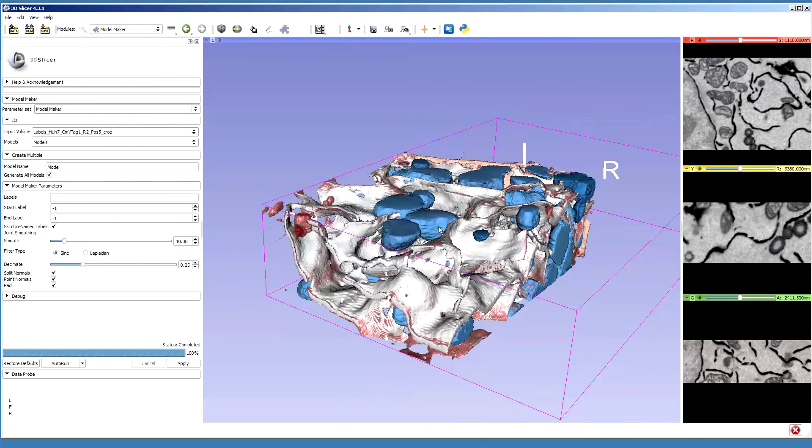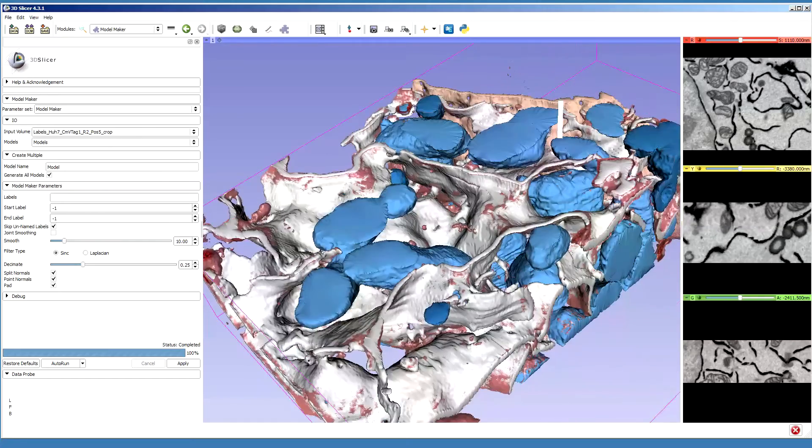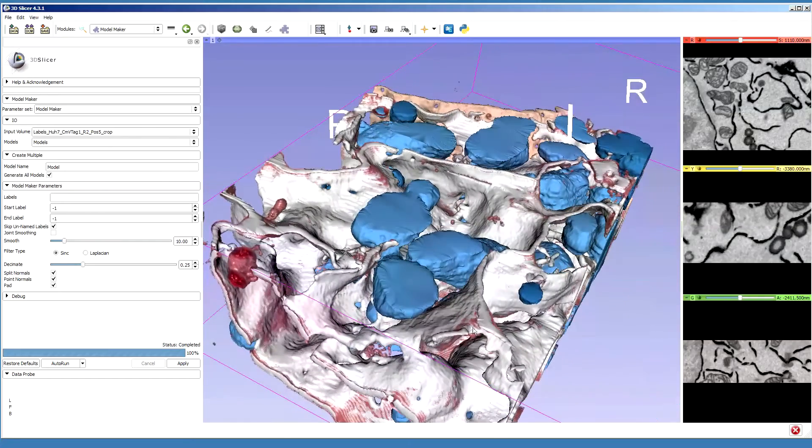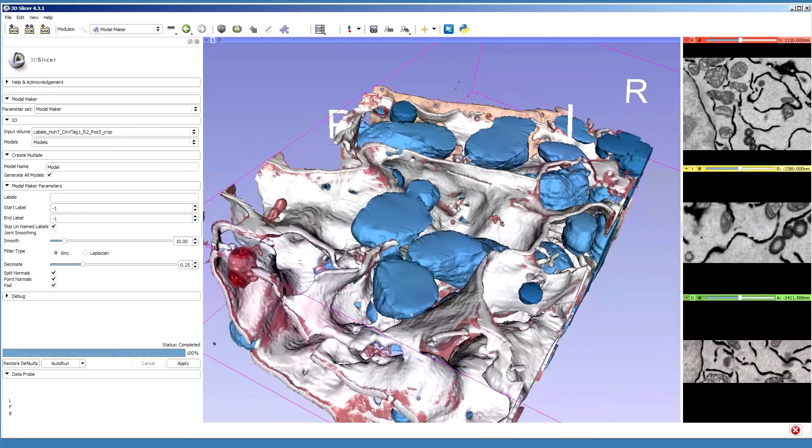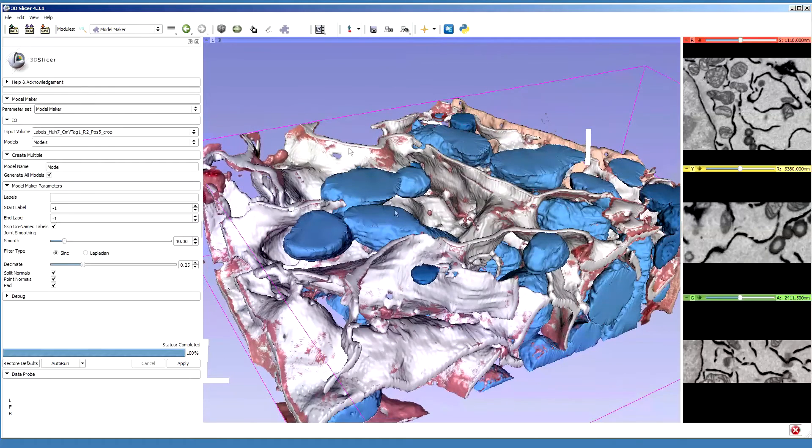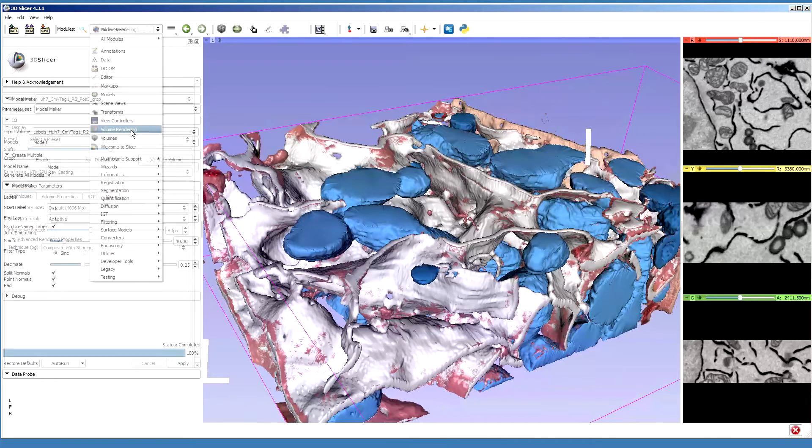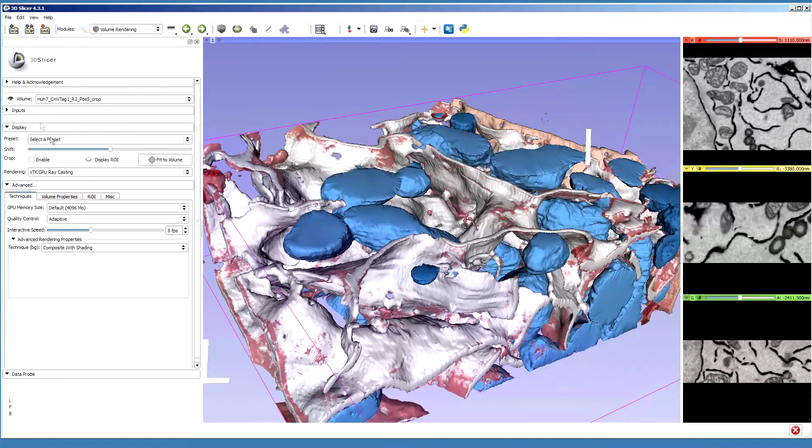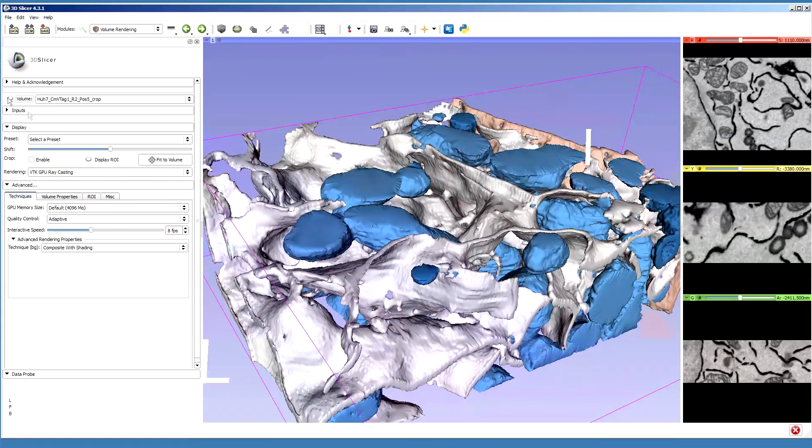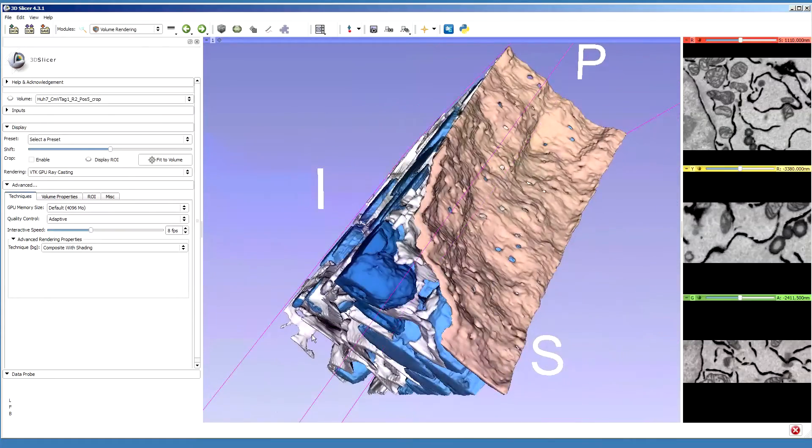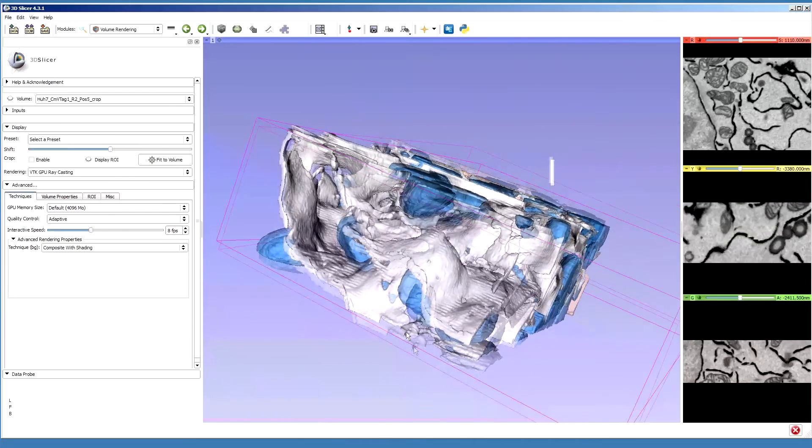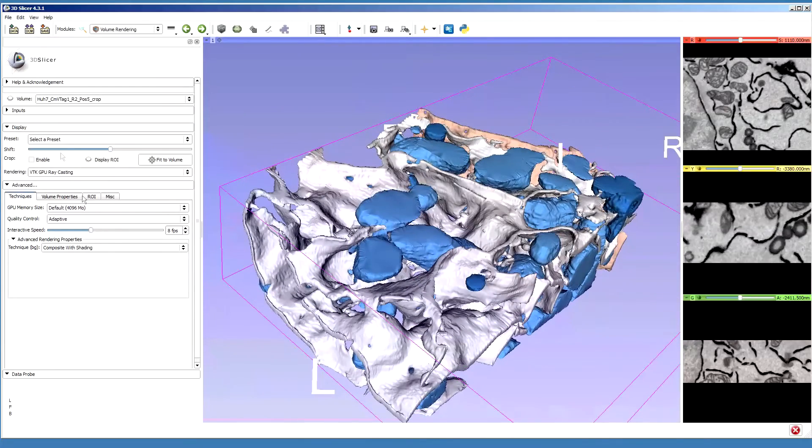Now when it's done, we can see our model which is shown above the volume rendering. We can go to the volume rendering and turn it off. Then it will allow us to see the model as it was segmented.